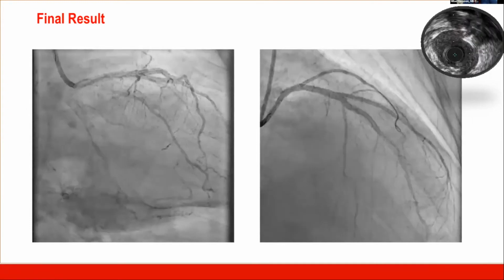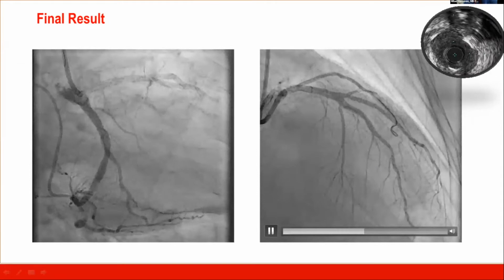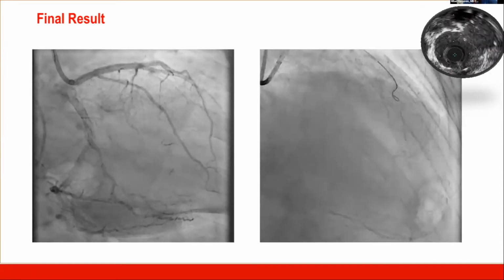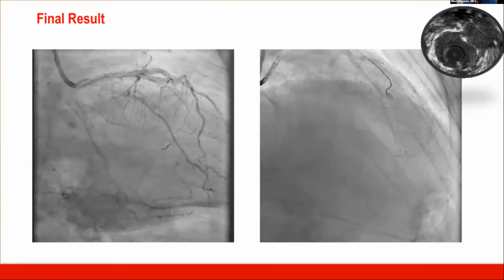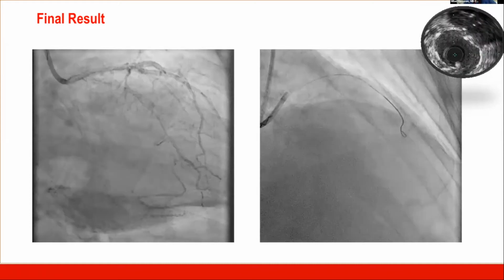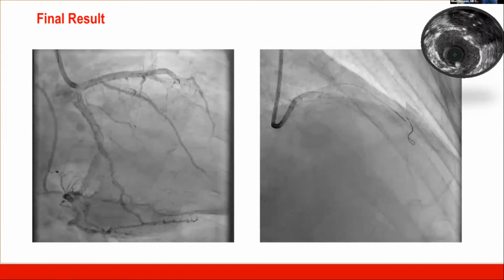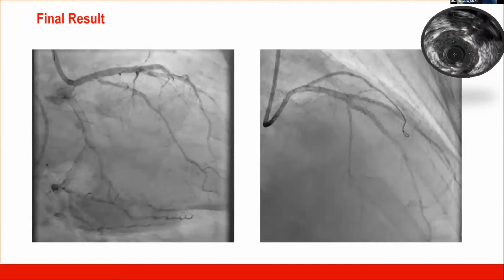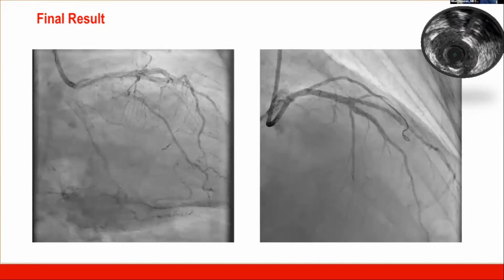We have seen this patient again in our clinic 2 months after the procedure, and he's doing absolutely fine, free of angina, back to his normal activity, and therefore we did not plan any further intervention, in the sense there's no need for attempting any CTO for the right coronary artery. Before moving to the learning point, did I answer any of your queries yet?